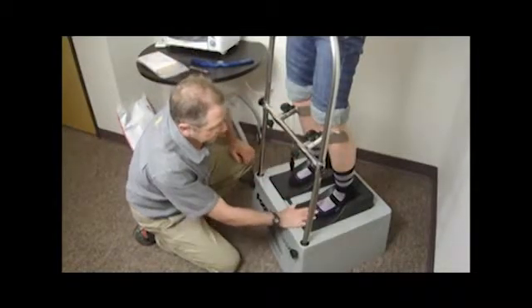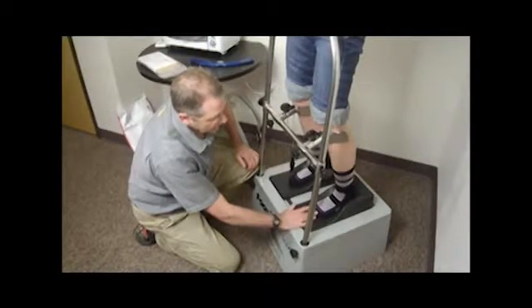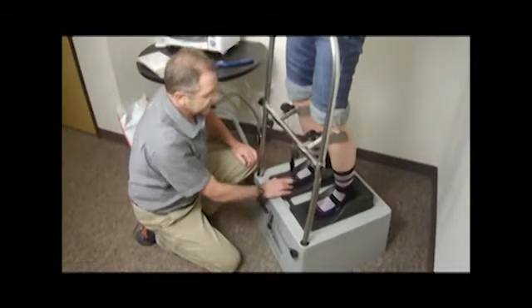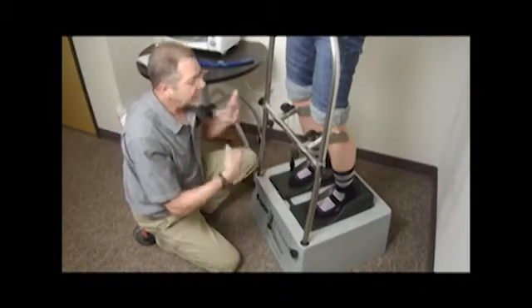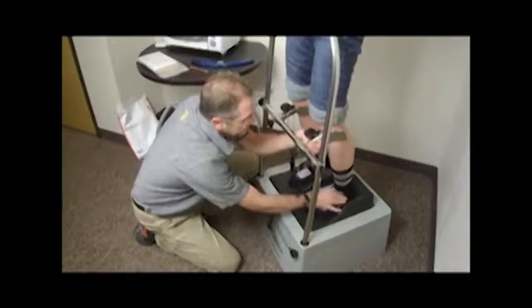Now, in the normal alignment, it's somewhere between the first and third toe. On the left here, we have it aligned between the second and third. And on the right, it's aligned pretty much over the second. So there is some change in her alignment, which may be either A, finding the subtalar alignment correctly. Let's try this again.